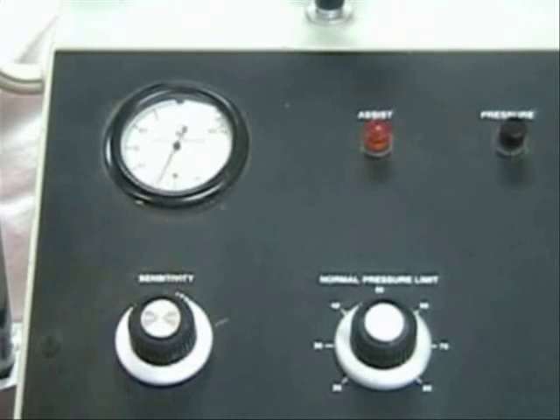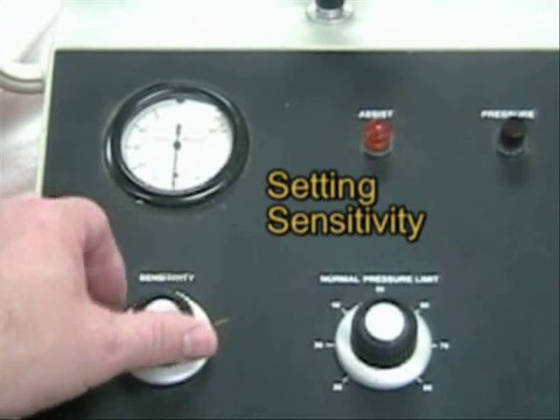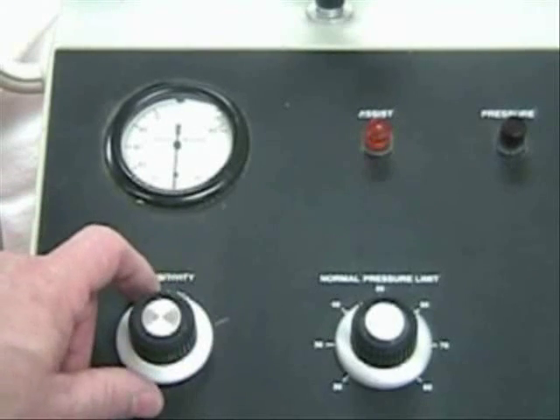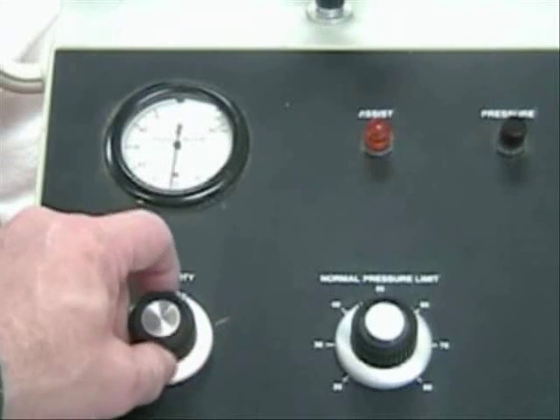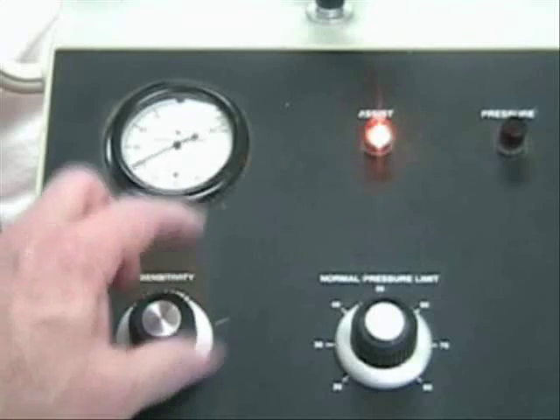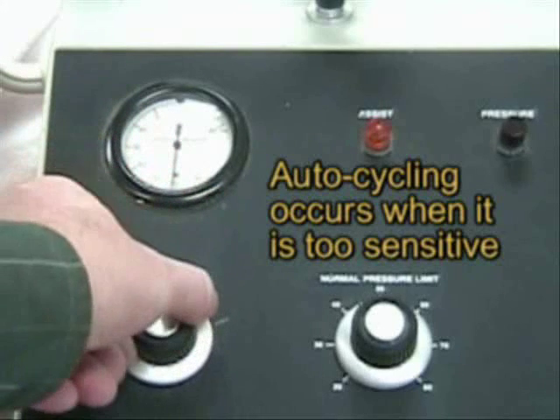Now we're going to take a look at the sensitivity. To set the sensitivity, you turn it all the way towards the increase, which makes it more sensitive. When the assist light comes on, you know you're auto-cycling the ventilator, so you back it off about half a turn.